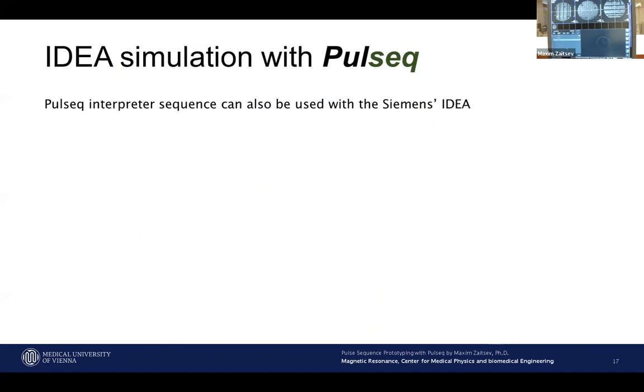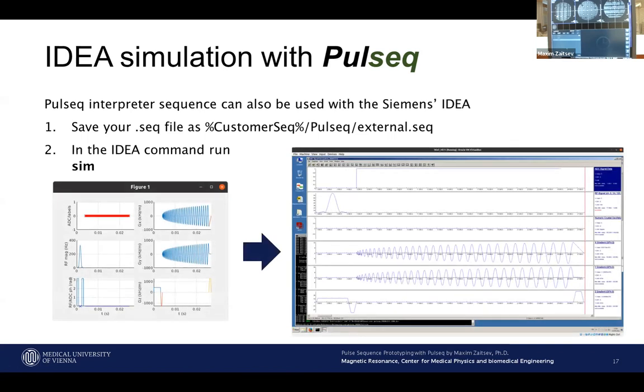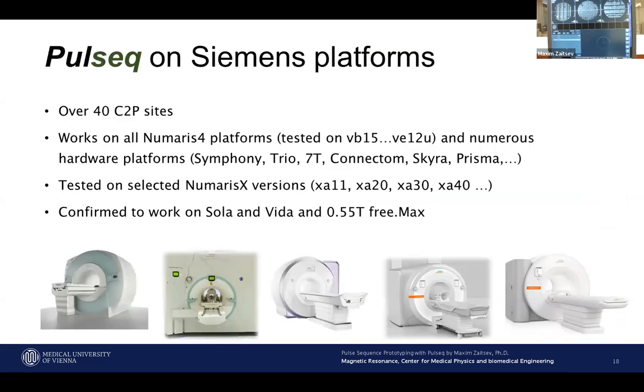We can also run the interpreter in the Siemens IDEA environment, and you can save the file. Basically, you have to create this path on your system and save the file to that location. Then if you run the simulator, you can simulate the sequence also in IDEA. On my laptop, I have this setup. If there are some questions, we can have a look, and I will show you how to do that again.